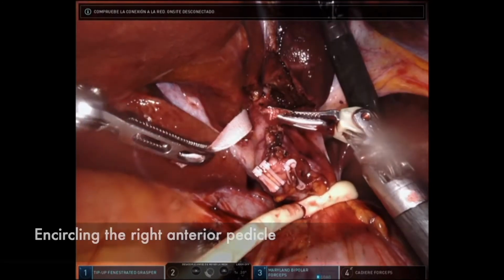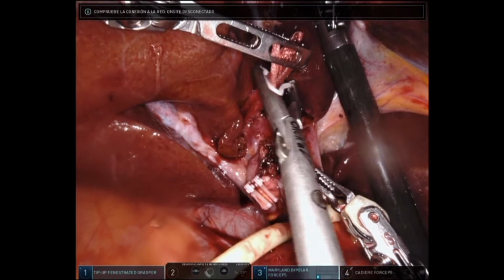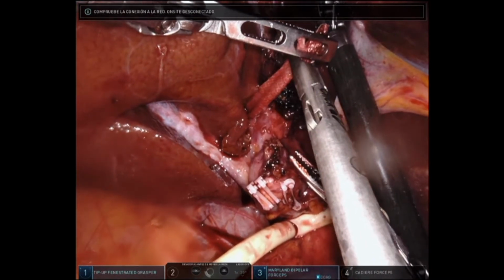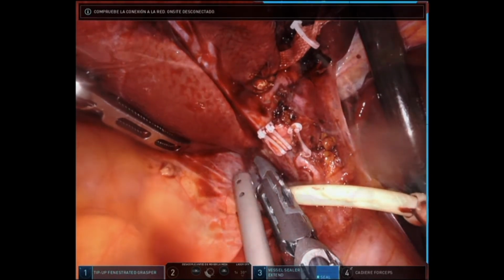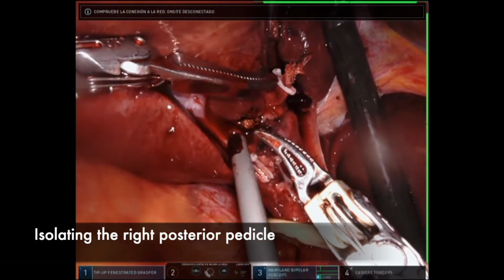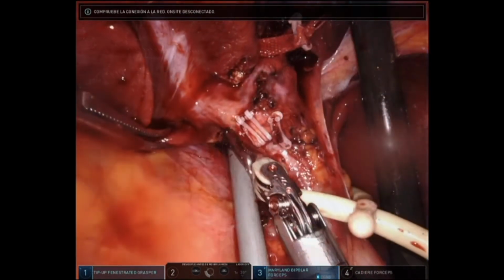Next, the right anterior pedicle is identified. To do this, the Laennec capsule is separated with blunt maneuvers at gates 4 and 5, eventually surrounding the pedicle with a tape. The pedicle is completely surrounded and can later be clamped to mark its exact extension.